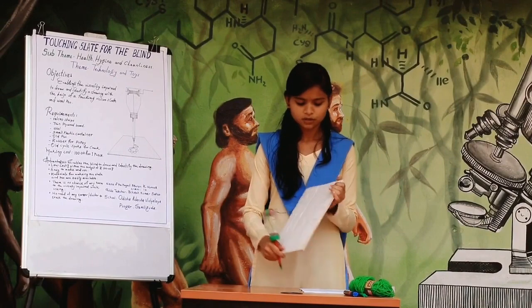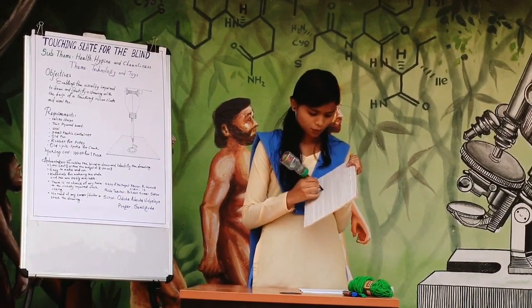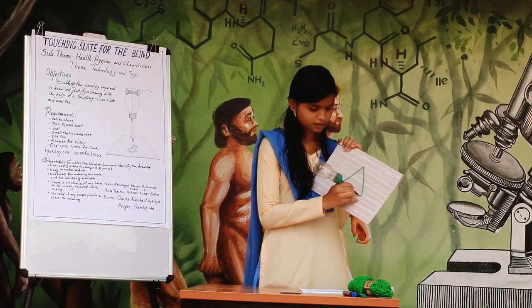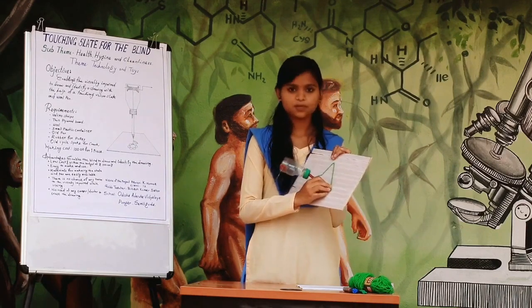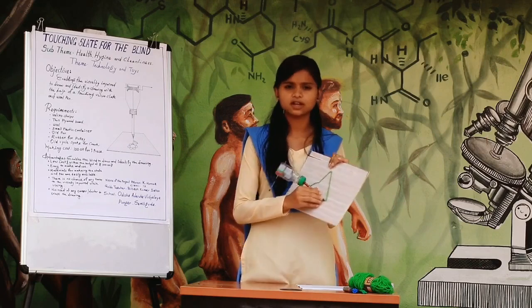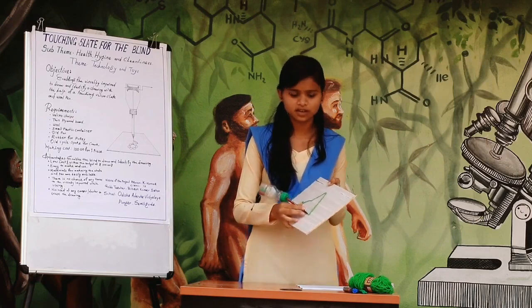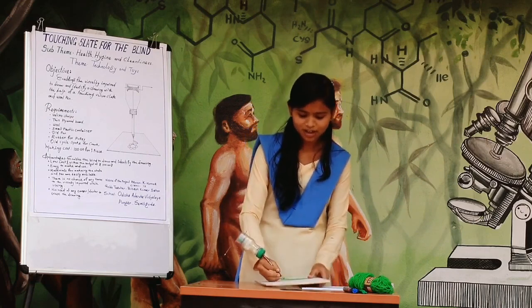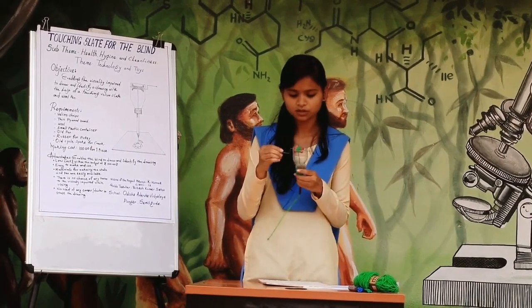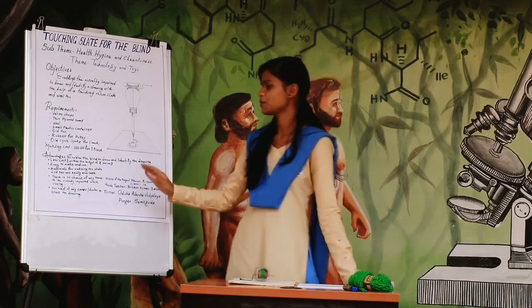Now we will see how to use the touching slate. To draw, one has to hold the pen. Then the wool will come out from the pen and get adhered on the male Velcro strips. The visually impaired or blind person will sense it through their fingertips and recognize what has been drawn. For erasing, we won't need any duster or eraser — we simply pull out the wool from the Velcro strip and it gets reversed back into the pen through the help of the pulley.